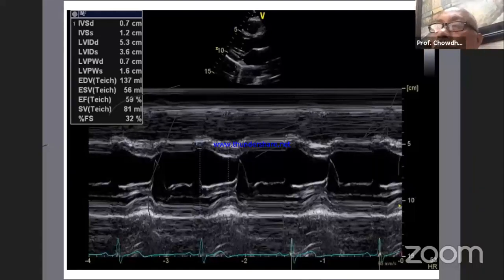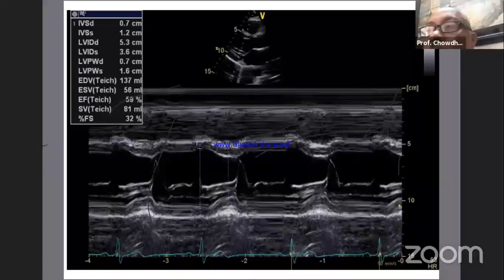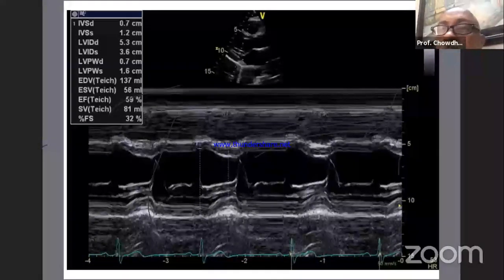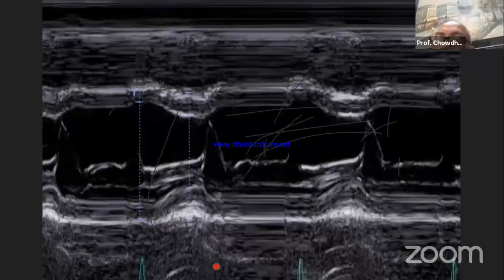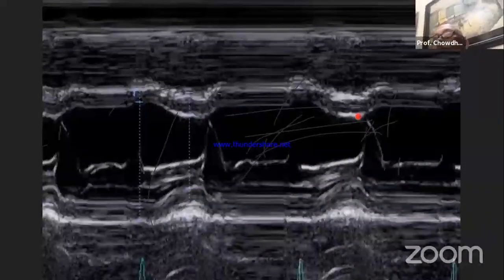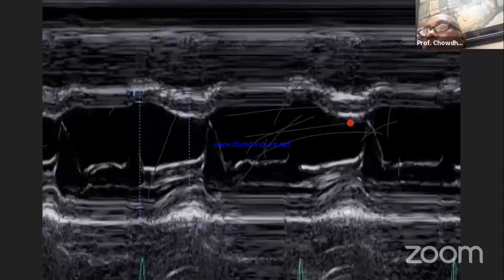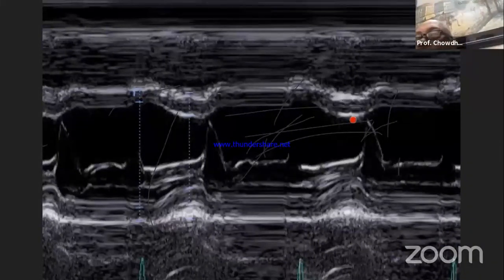During systolic measurement, when we do not have the ECG, it should be the lowest-most portion of the septum, wherever the lowest point is, and then we should proceed toward the posterior wall. And when we have the ECG, then the ECG should guide us to the end systole.